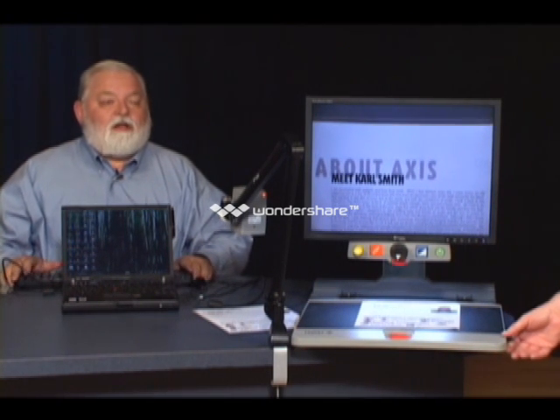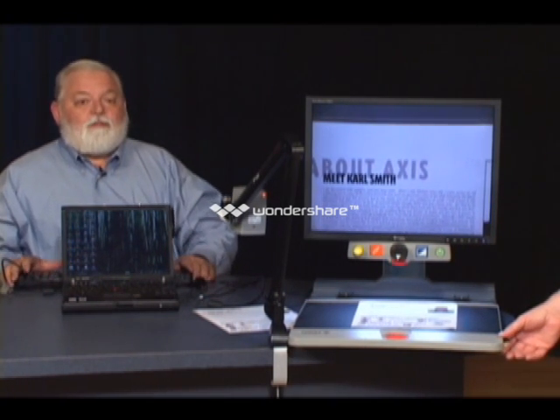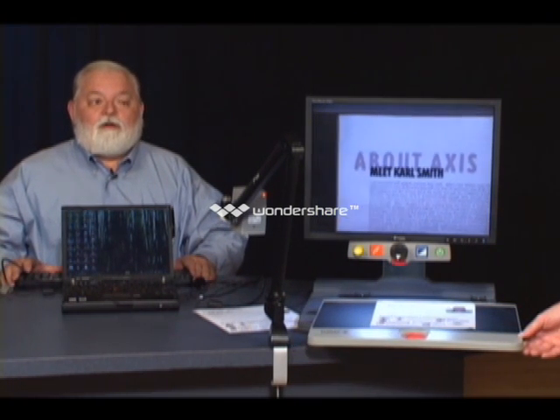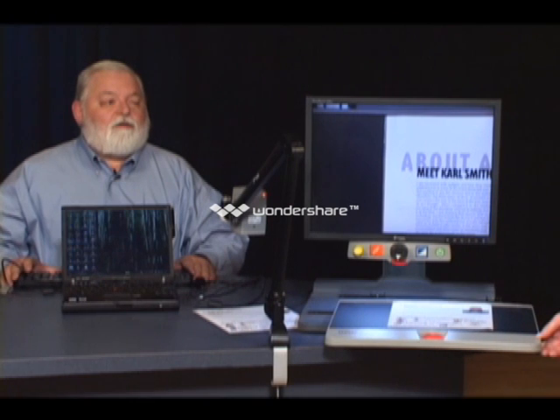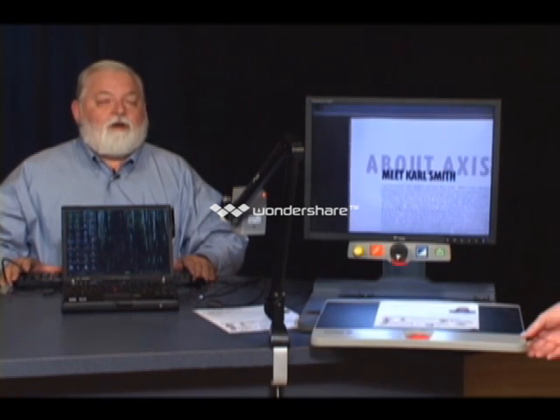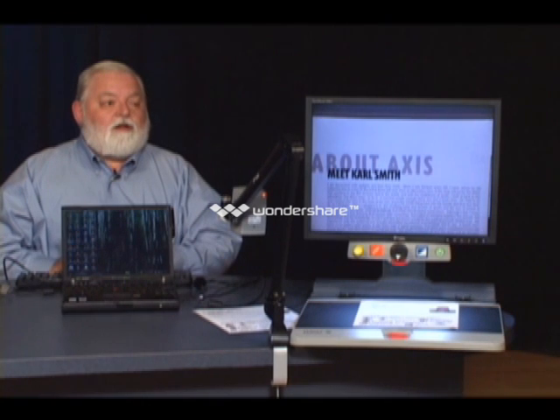Move it across, and then when you're done with that line, you bring it back to the right. You push the table away from you far enough to get the next line into view, and then move it across that way. I think that's a simpler way. It is less controls. It doesn't require another knob to change or something like that. It is simply an easy way to keep track, and it's already on there. You don't have to pay for any extra features that way.